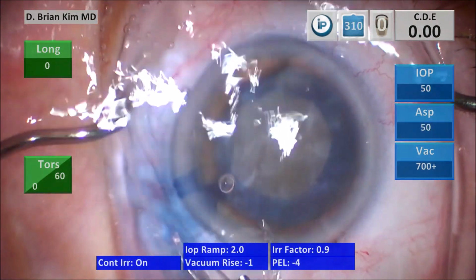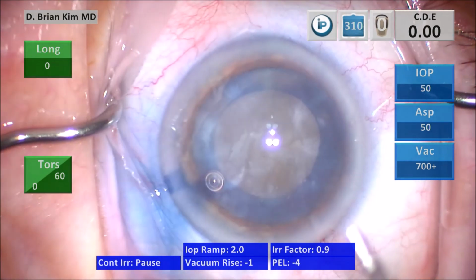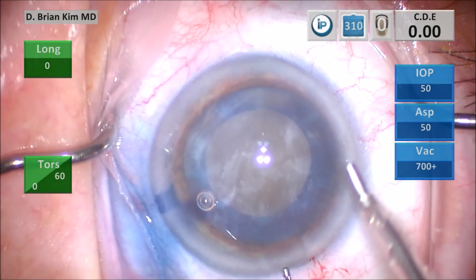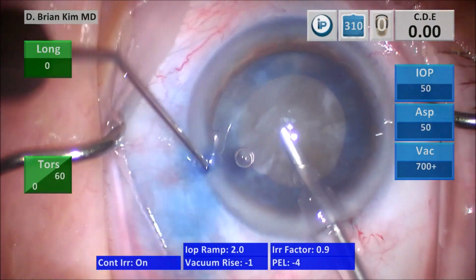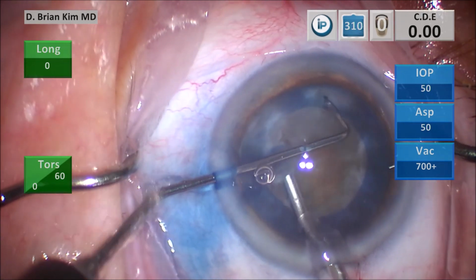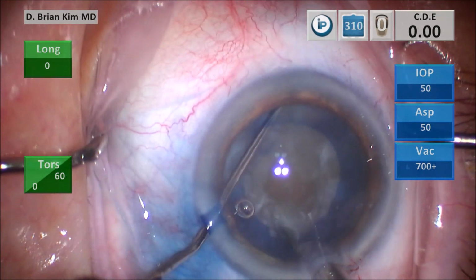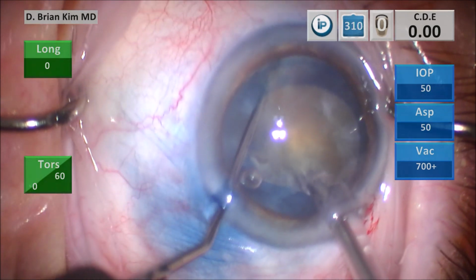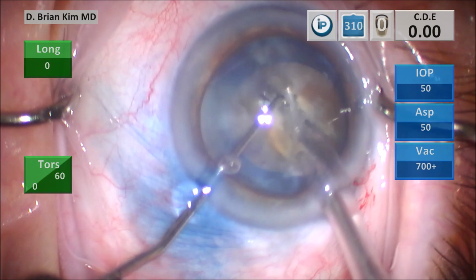I irrigate the surface of the eye. Lift the incision with a chopper, go in with irrigation off to minimize Descemet's trauma. Place the chopper underneath the rexis edge out to the equator contra-incisionally. Turn the phaco tip vertically sub-incisionally. Bring both instruments together, and I'm able to divide the lens. You can see there's still some posterior adhesion.